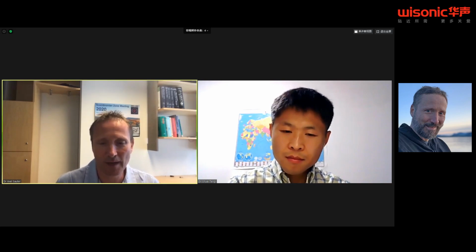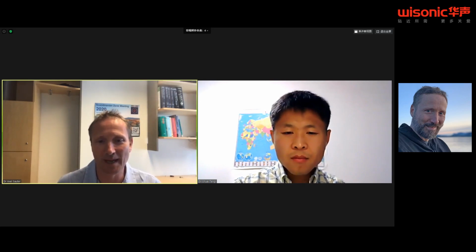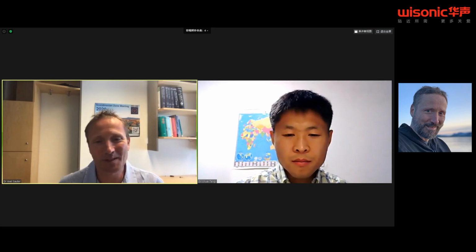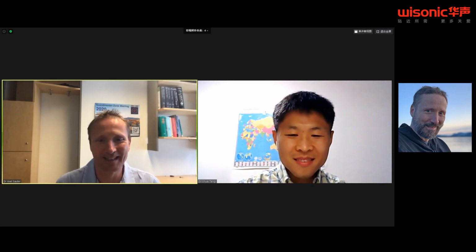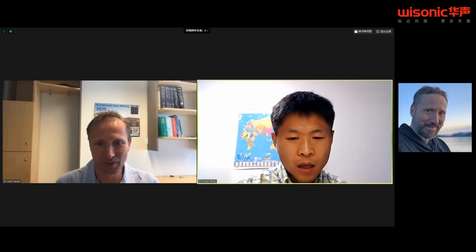In my hospital, we use dual guidance frequently, especially when it comes to complicated and deep block procedures. When it comes to something that we consider as a simple block where we have a good view of the needle, here we would only use ultrasound. But I cannot give this as an official recommendation. I don't know what the situation in China would be. I think it tends to be ultrasound guided, and we would use a nerve stimulator less and less.